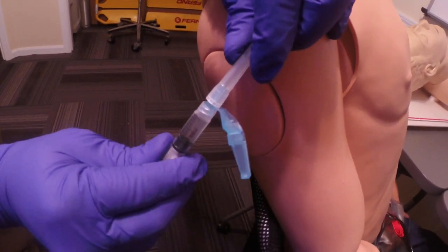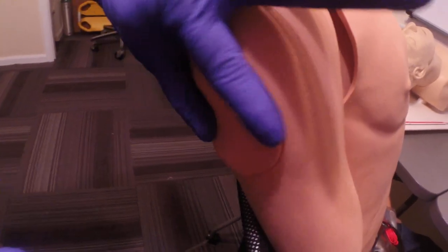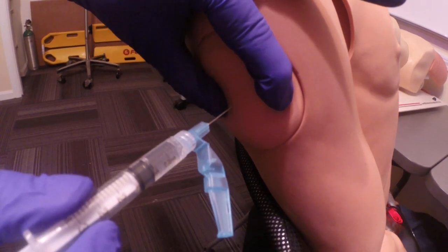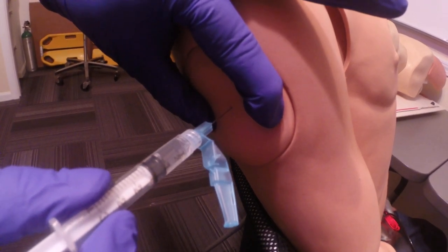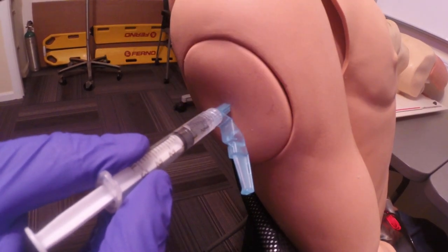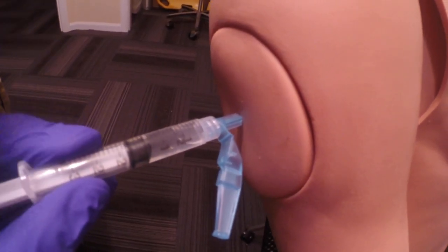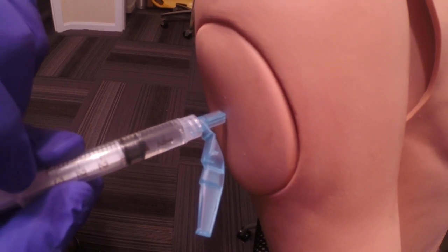We're going to remove our needle cap. Spread the skin, make it nice and taut. We're going to push the needle through into the muscle till the hub is touching the skin. Stabilize the needle, aspirate to make sure you have no blood. Inject at a moderate rate.